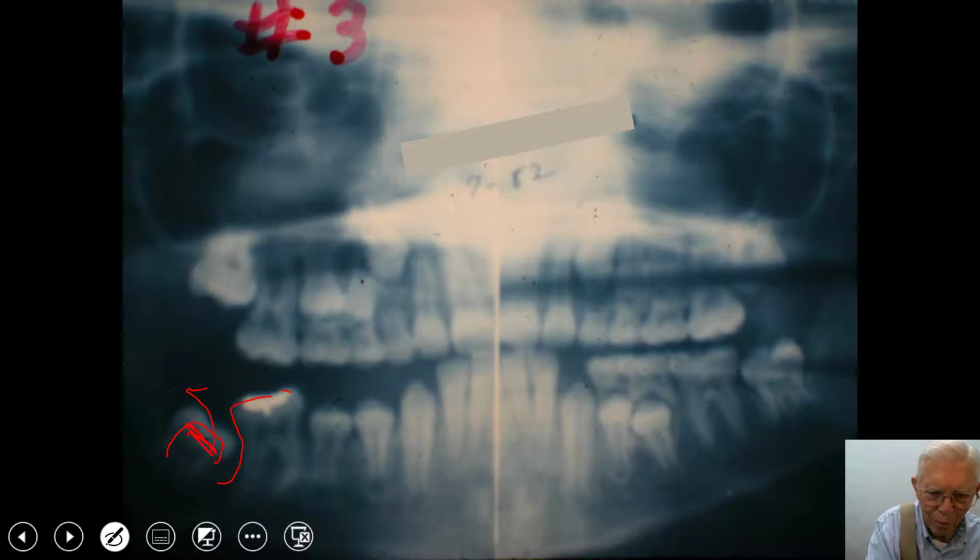And this is the 6-year molar, and this is the second molar, and the jaw is pretty short in here. And so I thought, well, I would have to move this tooth in this direction, and so to get there, I was going to have to eliminate something. So I took out the second bicuspid on that side of the mouth, thinking I would move this over and this tooth would straighten up a little bit and we could get it in. But the other side is working out fine. The people took the wisdom tooth out over here. This 12-year molar is coming in all right, and here is the upper 12-year molar coming down, and both of them are slow coming in.